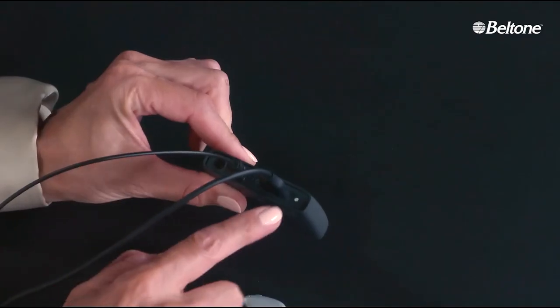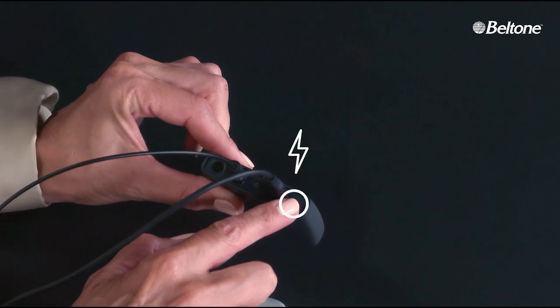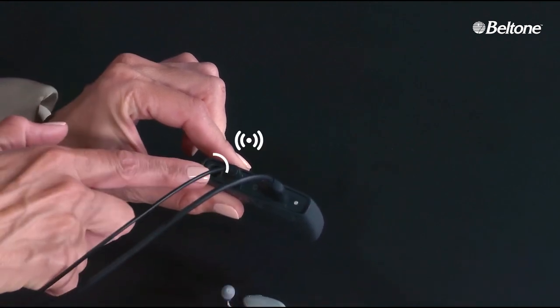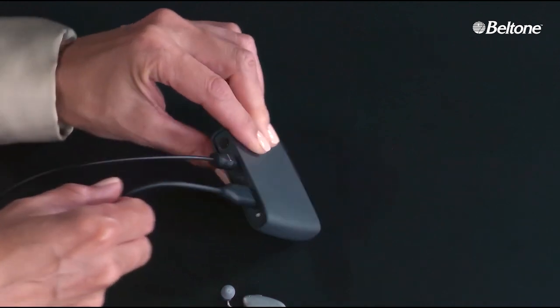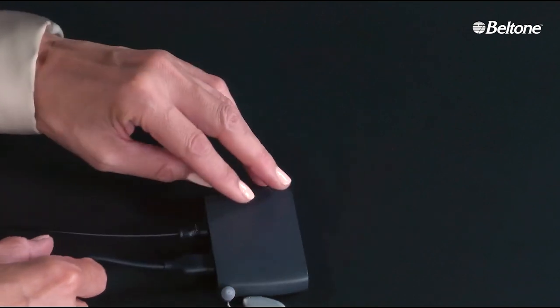The streamer is picked up to show the back side. A finger points to a lit-up dot on the right side, highlighted by a circle graphic, and a lightning bolt icon appears. The finger then points to the left-side button, also highlighted by a circle graphic, and an antenna icon appears.